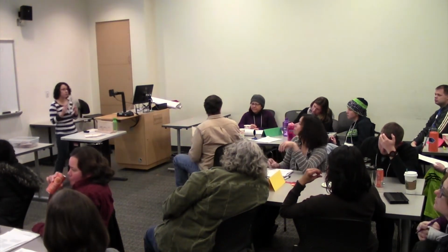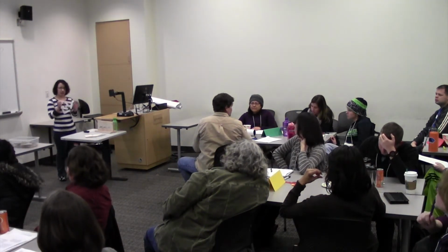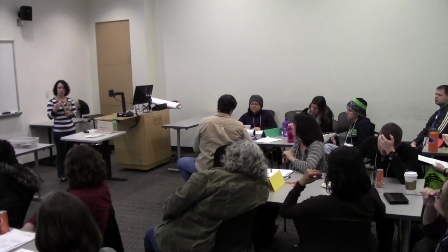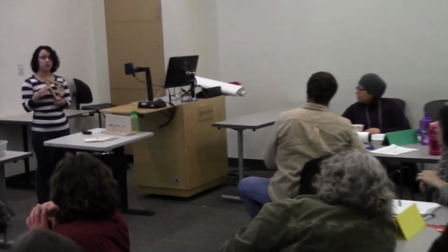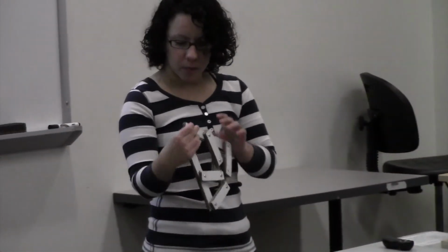The wood works pretty well too. The only thing is that I use pretty thick cardboard. I think I would recommend trying to find thinner cardboard because it gets pretty strong pretty fast too. But I wanted to make it stronger in this direction, so I actually used just 3 layers for this one. And it's strong, but I don't think it was strong enough. I think I would go with a couple more layers.